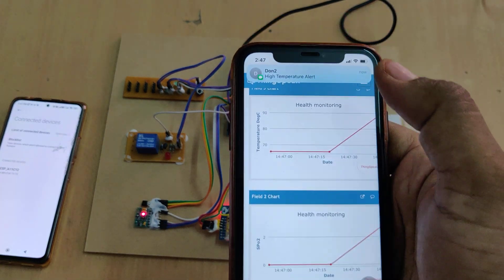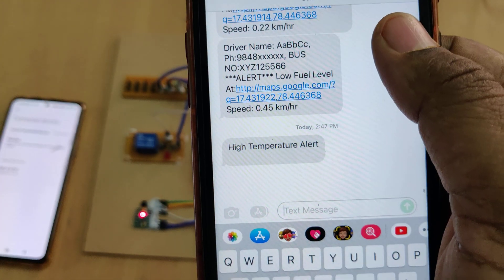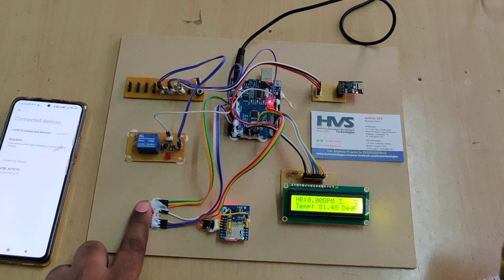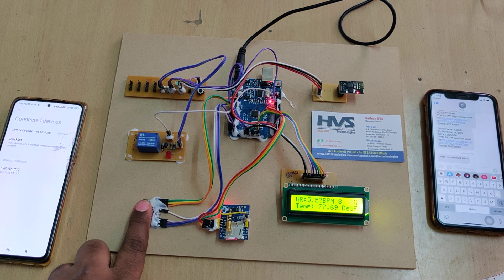The system sends an SMS alert to the person who called when the system was switched on. The alert message says 'High Temperature.' Similarly, if the heartbeat or SpO2 is too high or SpO2 is too low, you will also receive SMS alerts.